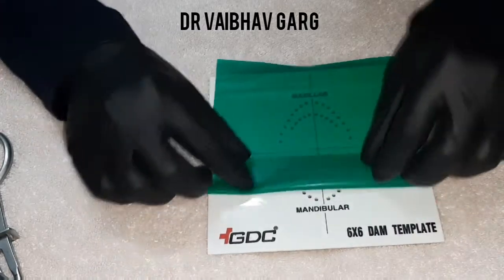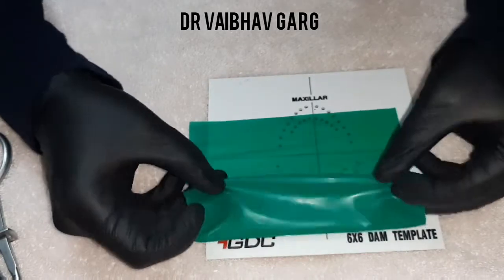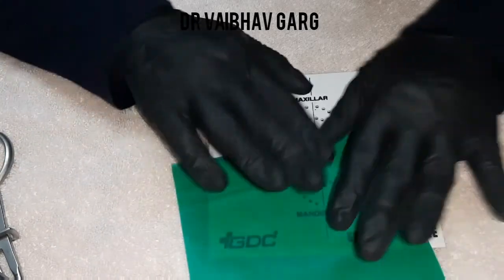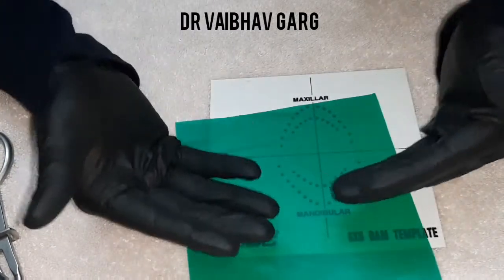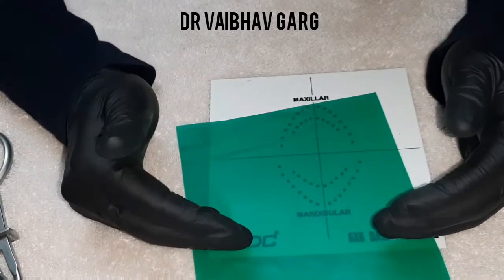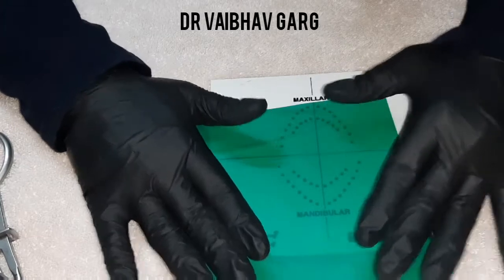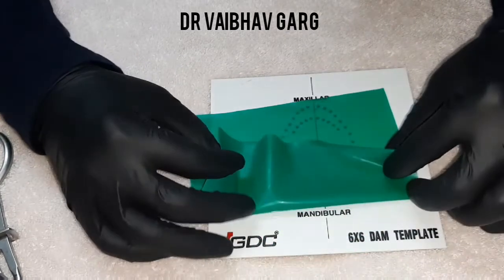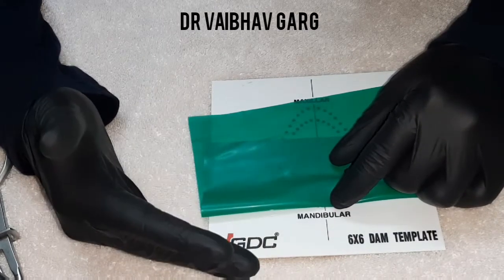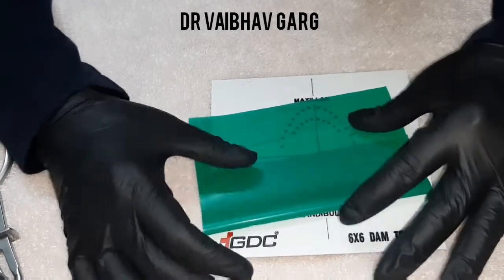The reflective surface is always towards the tooth surface or gingiva, and the matte finish is towards the occlusal surface of the tooth. When you do photography for cases, you need more matte surfaces to avoid reflections. The reflective surface also has the advantage of reflecting saliva and the gingival sulcus.